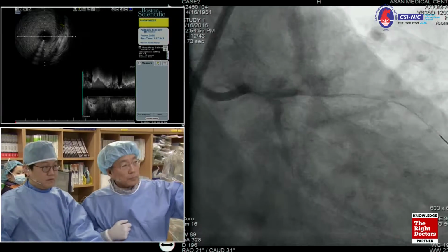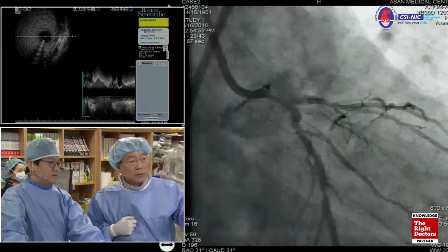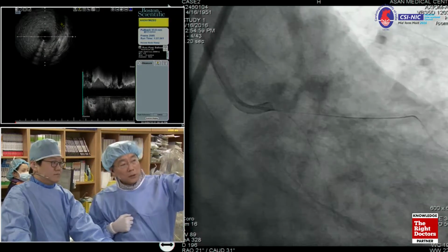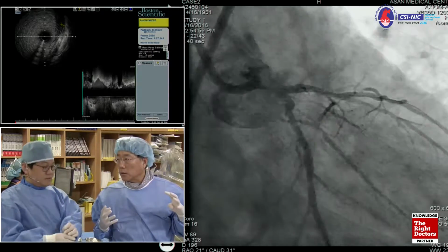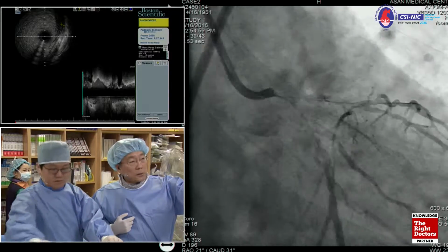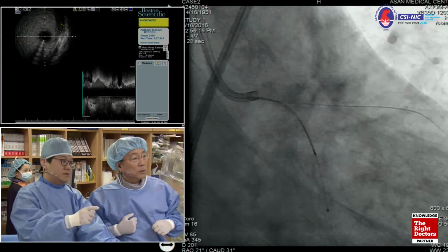And so, this is very complex, right? Yeah. Diffuse disease, however, I'm not too concerned. It's just stent crush for that, right? Yes. What do you think? Two-stent technique? Good. And for the stent landing zones for the LAD, next. Would you show us a previous one? Next. What do you think, Dr. Ahn?